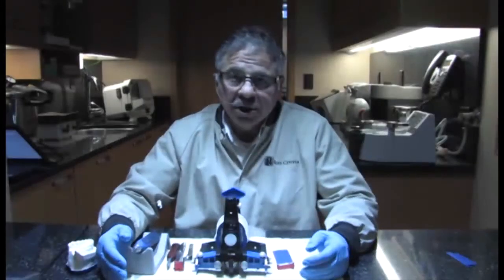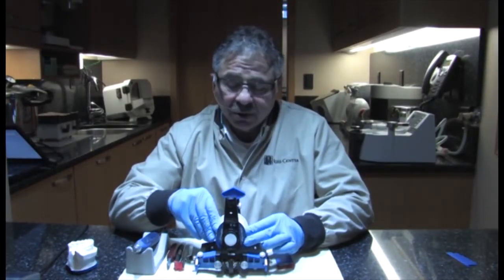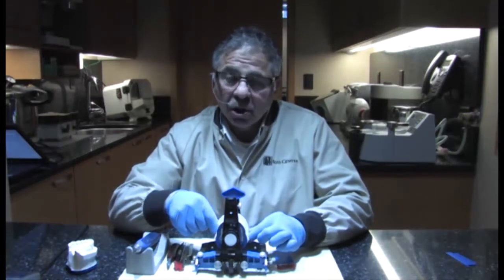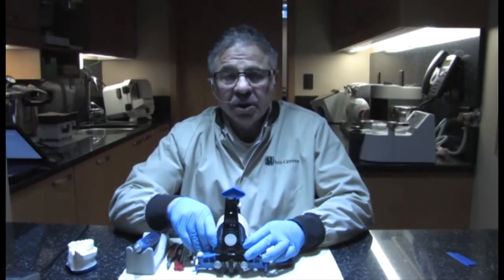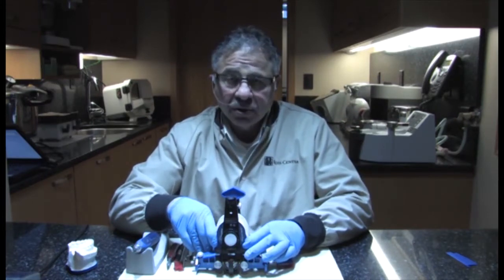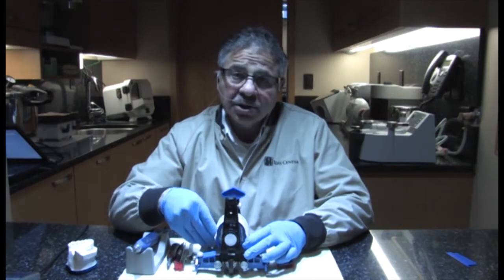We're ready to do our trial equilibration. As you recall, we've already mounted the maxillary cast based on the dentofacial analyzer. By doing so, we can also evaluate where the position of the maxillary arch sits relative to natural head posture. Even though we're only doing equilibration, it's a wonderful starting point, because if there were any teeth that hung down beyond the occlusal plane, and those teeth also were the teeth that were in premature contact, you can appreciate we would like to shorten those teeth as we begin the equilibration.